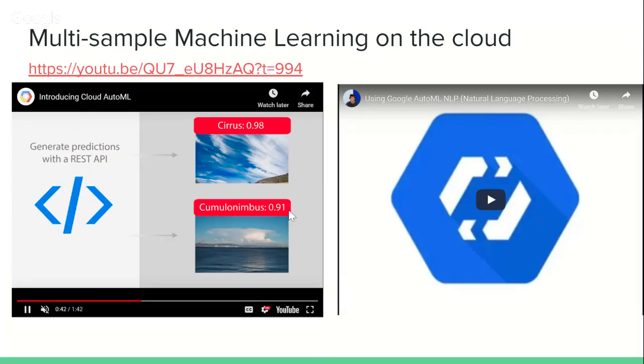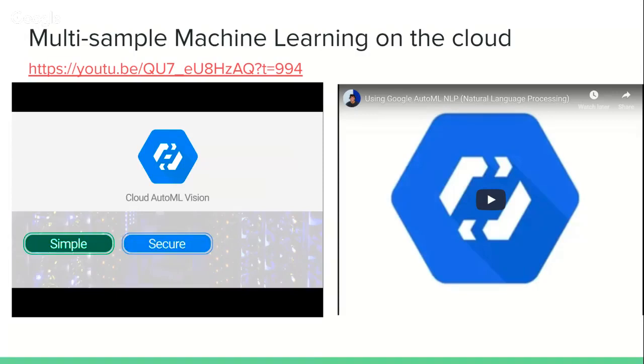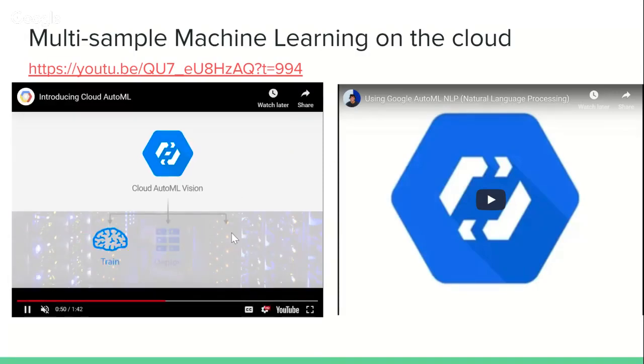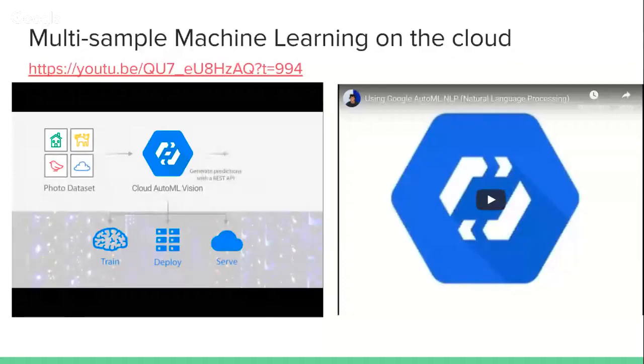And in this slide deck, we're going to assume that you just need to build a classifier. So we're going to fit the system with a bunch of samples that we know what they are, that are of known state, splitting them into training and validation.